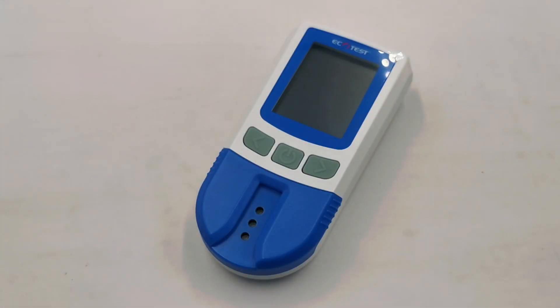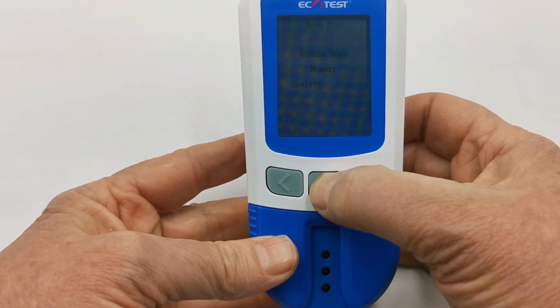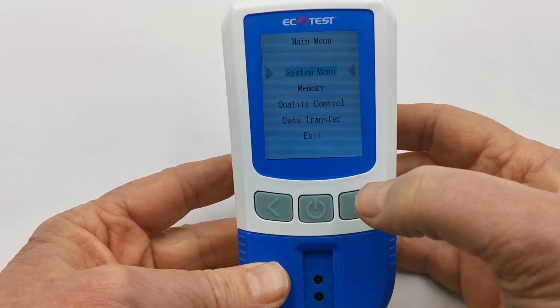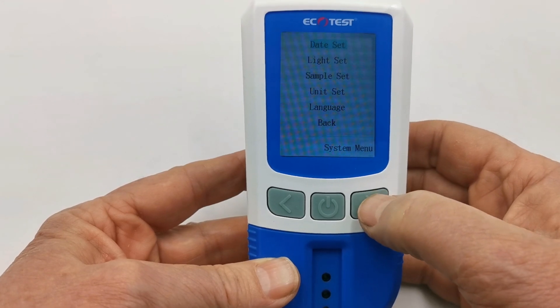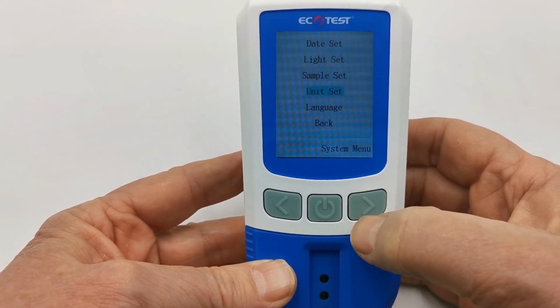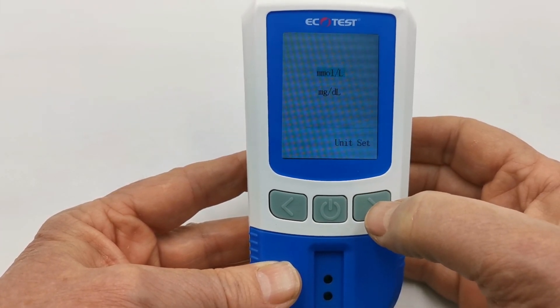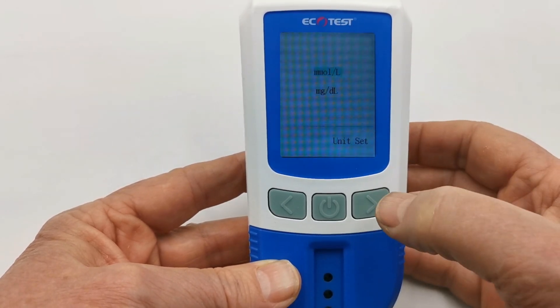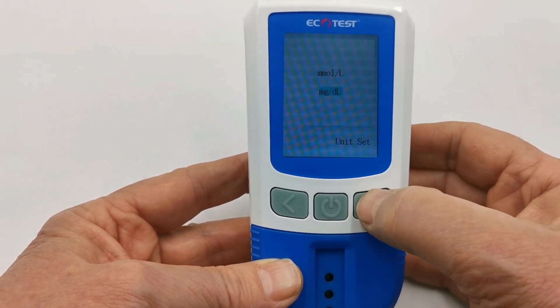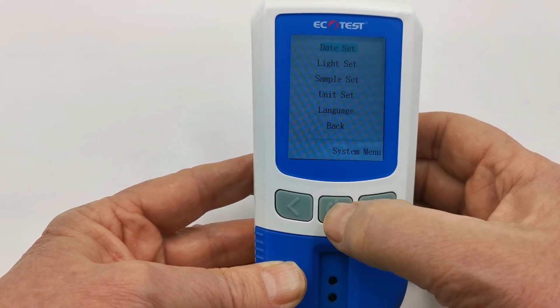In this section we're going to show you how to select the display units. Take the meter and depress the power button for two seconds — you'll see the menu come up. Enter the system menu by pressing the power button again and navigate down to unit set. Press the power button and it will give you the option to toggle between millimoles per litre and milligrams per decilitre. Most UK readings are reported in millimoles per litre but you can select between the two at leisure. Once you've selected the one of choice, press the power button again.